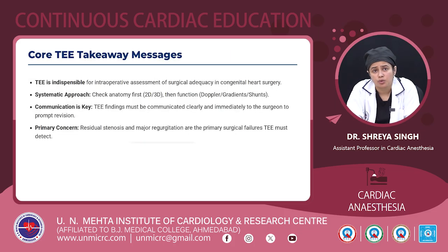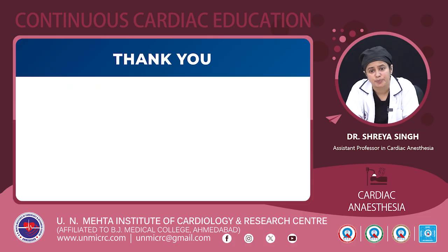So the core TEE takeaway messages are: TEE is indispensable for intraoperative assessment of surgical adequacy in congenital heart surgery. We need to check the anatomy first, either with 2D or 3D, and then the function via Doppler gradients or shunts. Communication is key, so the TEE findings must be communicated clearly and immediately to the surgeon for prompt revision. And any residual stenosis or major regurgitation are the primary surgical failures that the TEE should be able to detect. Thank you.